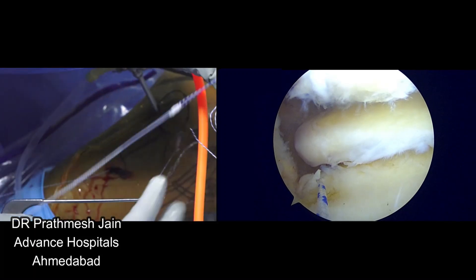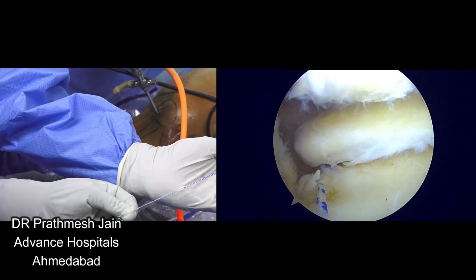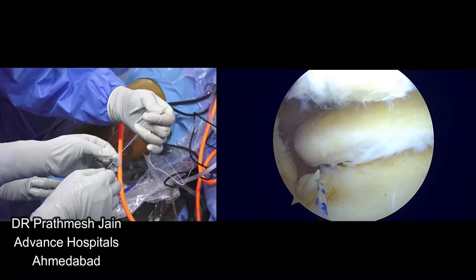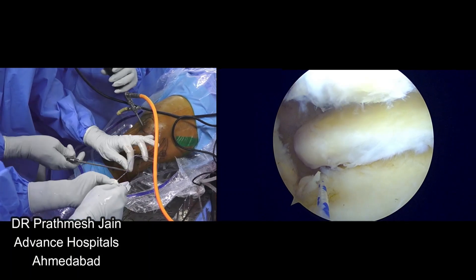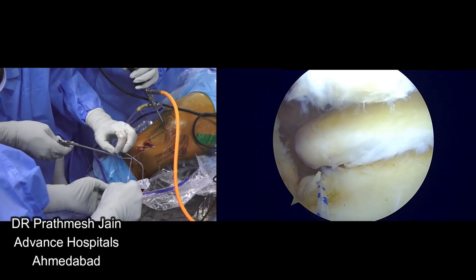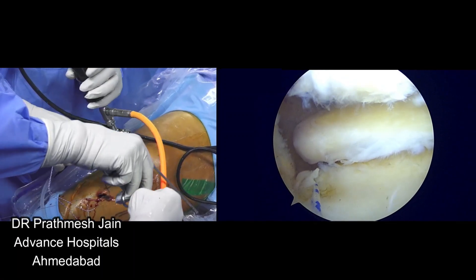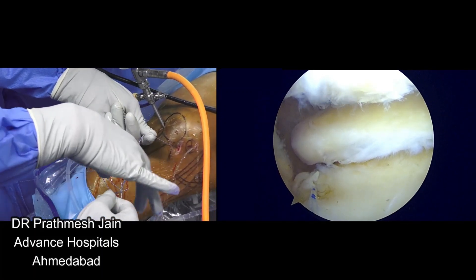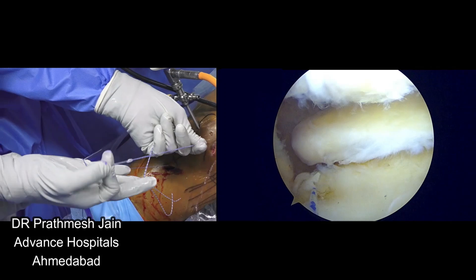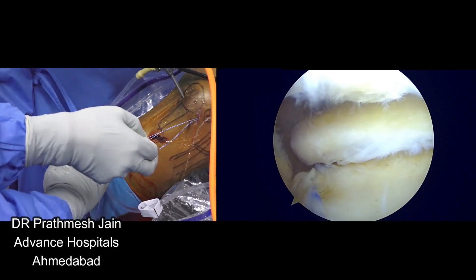This is the root fix anchor — this is a retrograde anchor. You can see the pulling suture and it is loaded with four sutures, again number zero sutures. What I do is I will pass it in a retrograde fashion through this — just be slow in this step. What we are doing is we are pulling it from down from the tibia. This is the anchor which is there; you can see the anchor and you can ask your assistant to pull it.